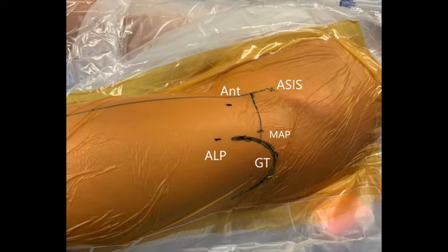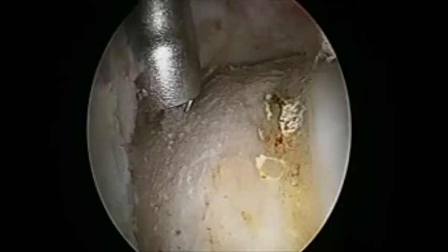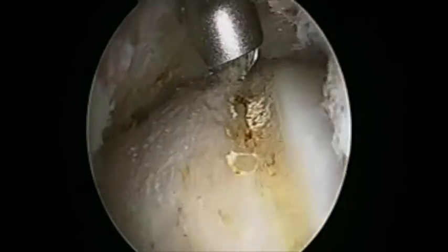The procedure is performed in the supine position on a post-free hip distraction table with portals as outlined here. Prior to the start of the procedure, the template of resection is projected in the OR suite. We start the video after the diagnostic arthroscopy and labral repairs have been performed.